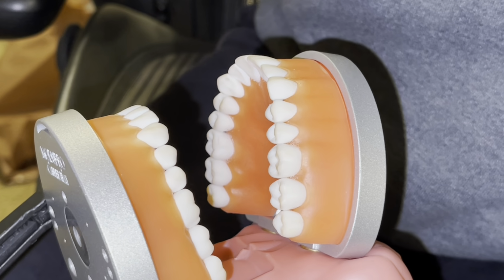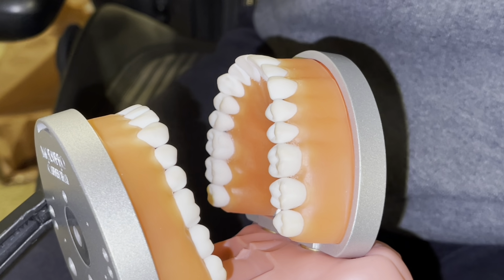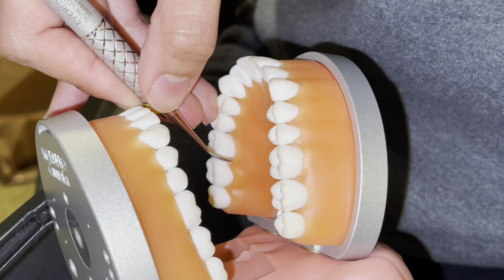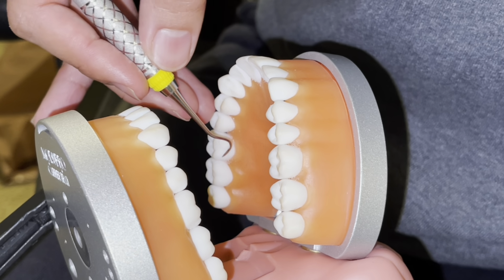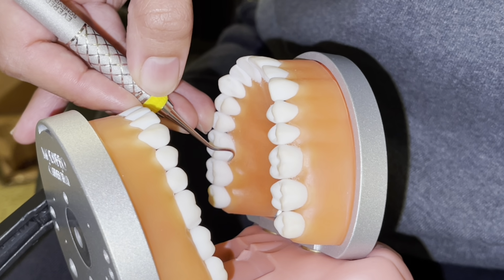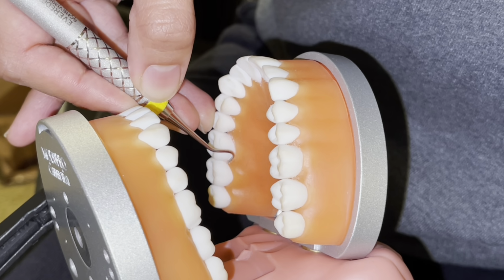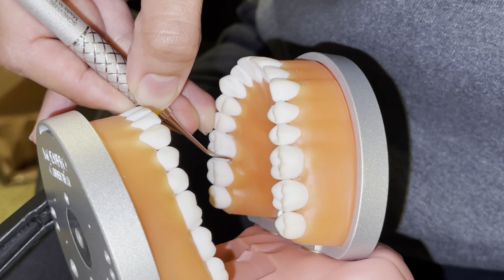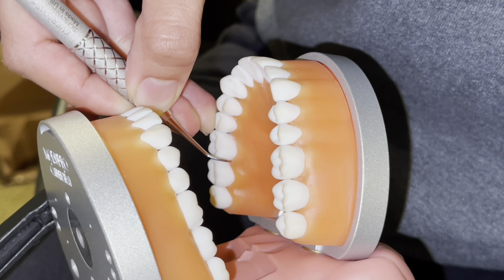So now I'm sitting at the 10-11 o'clock position. I will be scaling teeth number 3 and 4 lingual aspects. I want to make sure I'm using the correct working end as the functional shank goes up and over. My elbow will actually start away from me and pivot in towards the distal aspect, inserting at a 70 to 80 degree angulation, and activate an oblique stroke up, down, pivot, roll, bring the elbow in, interproximal, go up, down.